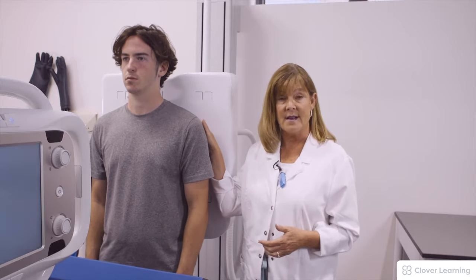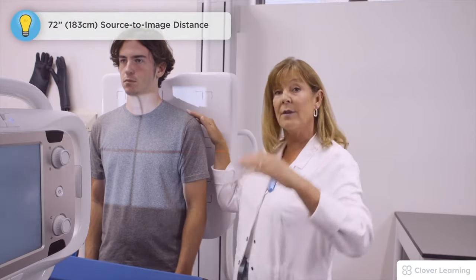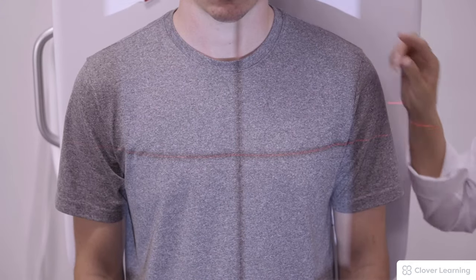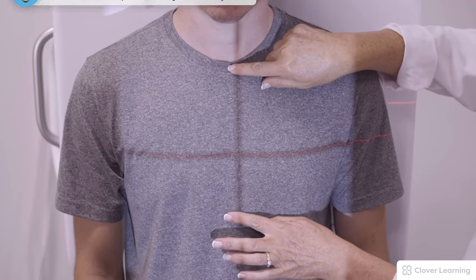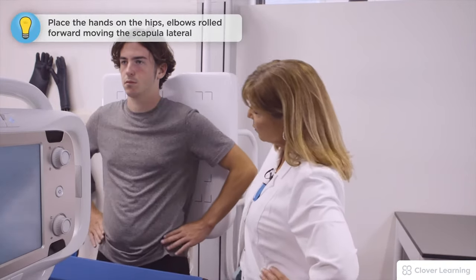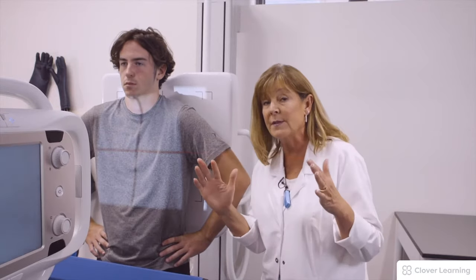We are demonstrating a posterior injury on the left-hand side. We start with the IR placed lengthwise in the upright bucky, centering the top margin of the IR one and a half to two inches above the patient's shoulders. The central ray is halfway between the jugular notch and the xiphoid.